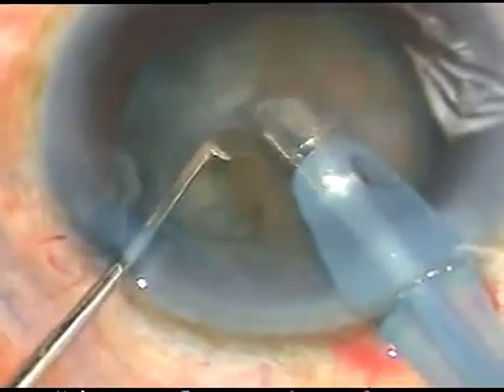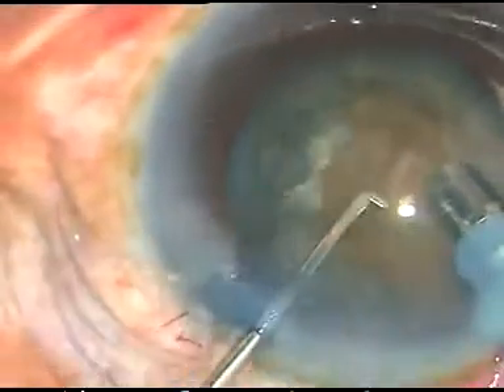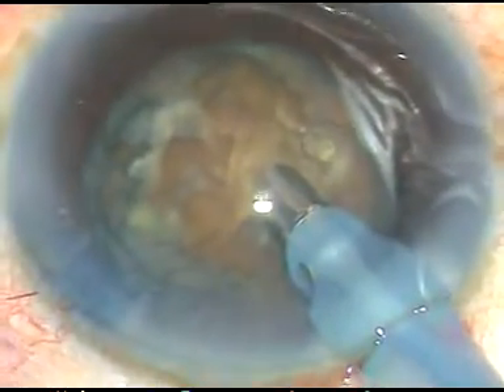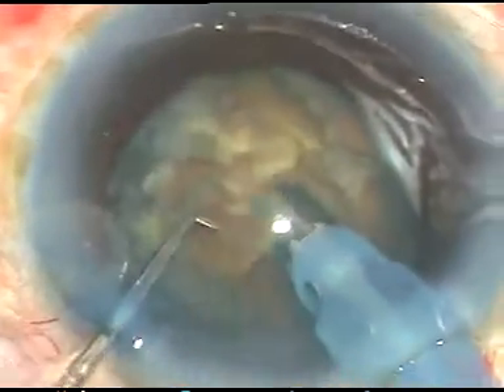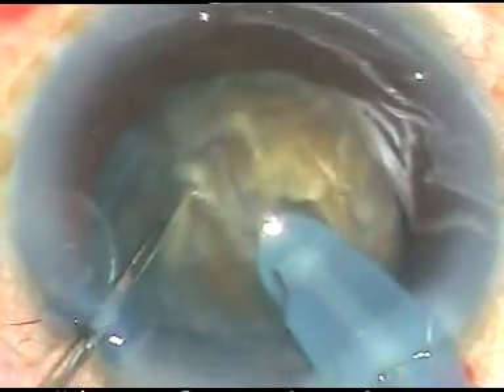In this case, I have planned to make a deep trench first — not a crater, but a trench — from 11 o'clock to 5 o'clock. In the bevel-down position, I am making the trench, and the trench is sufficiently deep now.